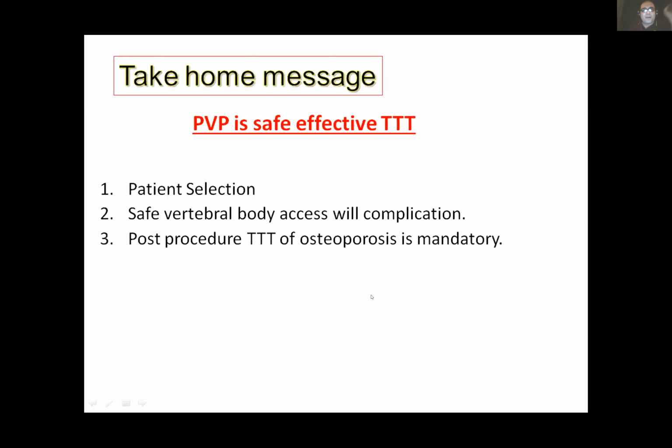So my take-home message: percutaneous vertebroplasty is safe and effective if you properly select your patient, if you follow a safe vertebral body access technique, and if you follow your patient post-operatively in the proper way.